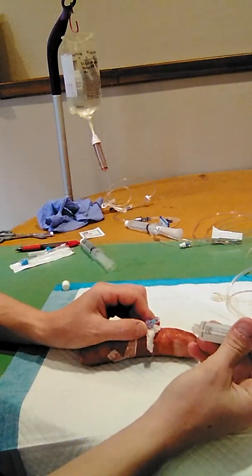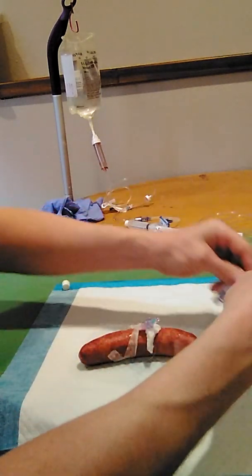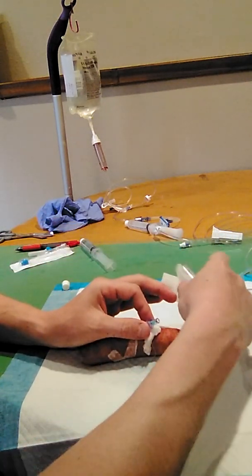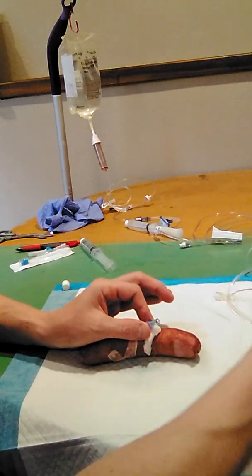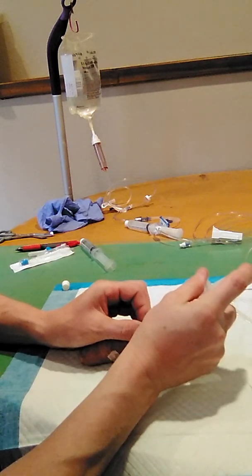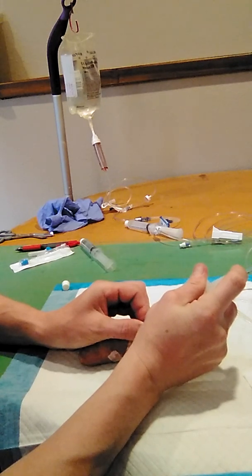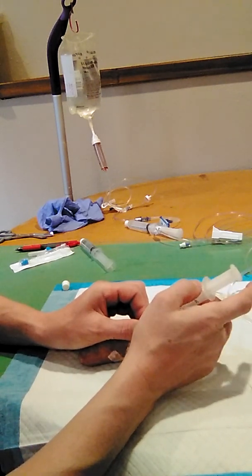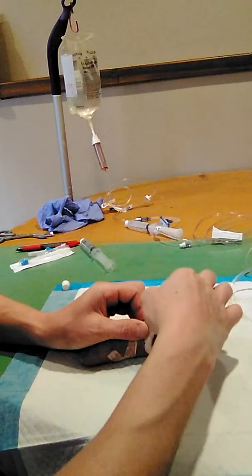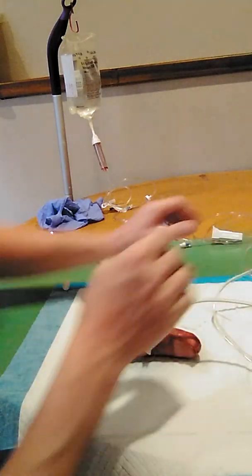And I'm going to obtain my 0.9% normal saline, and clean this hub with the alcohol, allowing it to dry, as well as cleaning this saline flush. I'm going to administer 5 milliliters. Okay. Reconnect this, seeing that it is still locked.